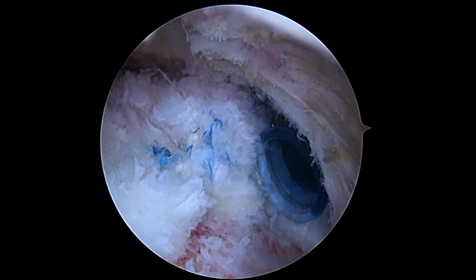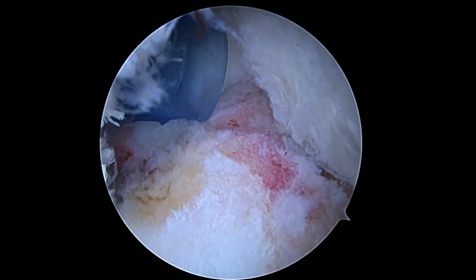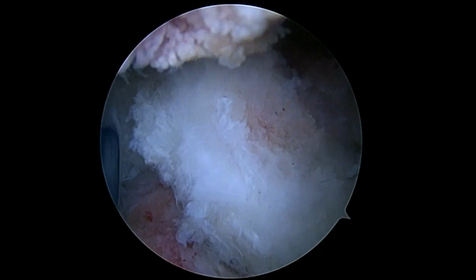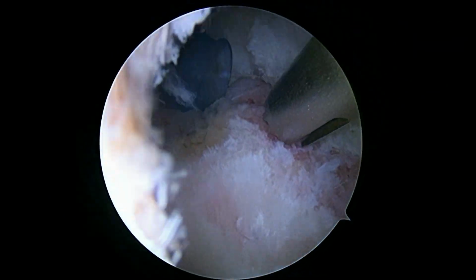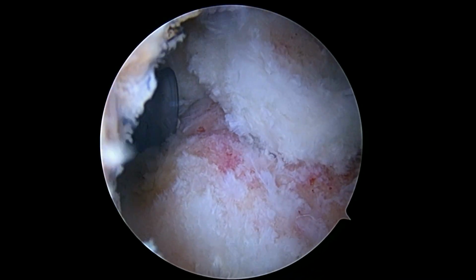Okay, hold that for a second. So, okay, so we've passed and tied all the sutures from the second anchor. So there's the first one way back there. There's the second one right here. And now we've still got room to place a third, maybe even a fourth. So we're going to place another anchor up here to close down this final gap. I actually am going to make another little spinal needle entry point.